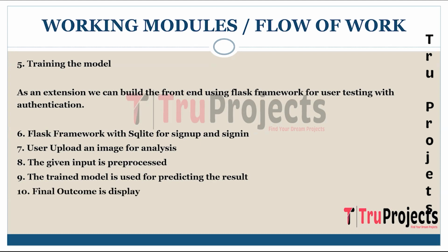Coming to the last step, which is displaying the final outcome. The ultimate results of the analysis, encompassing disease classification and any relevant findings, are presented to the user through the web interface. This final outcome serves to inform and assist users in understanding the analysis results.